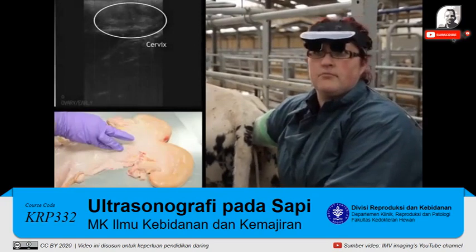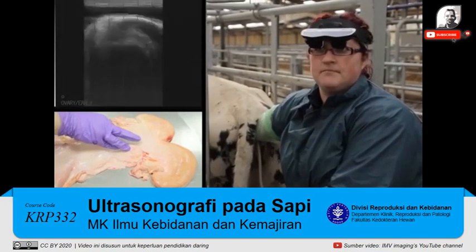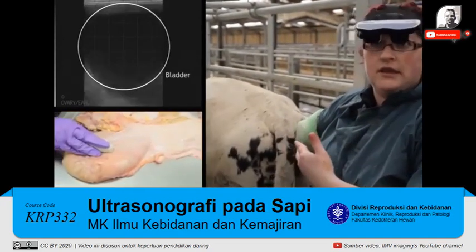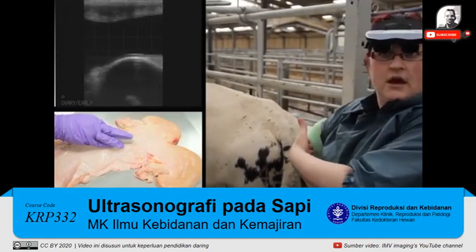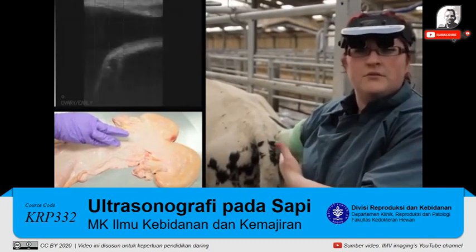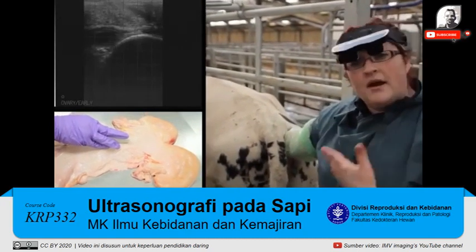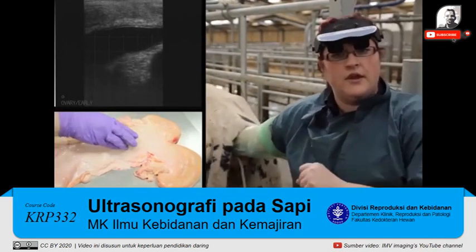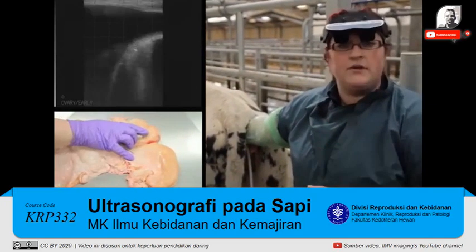We'll now locate the cervix, which is a firm tubular structure leading down into the rest of the reproductive tract — and there it is. Don't confuse it with the bladder, which you'll often see right as you enter. I'm not pushing excessively hard at this point. If the cow has a significant amount of fecal material, we'll need to remove that to improve contact and image quality. In a multiparous cow, we may need to grasp the cervix or intercorneal ligament and retract the uterus back into the pelvic canal.